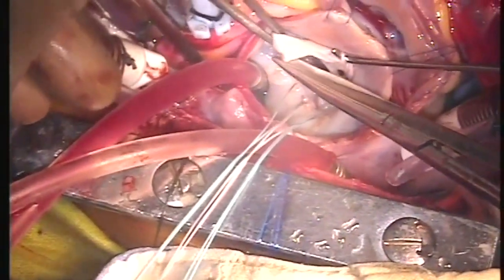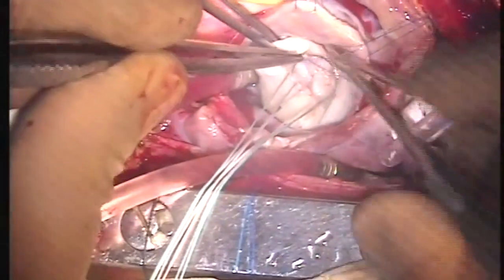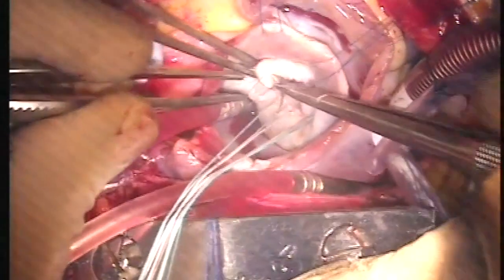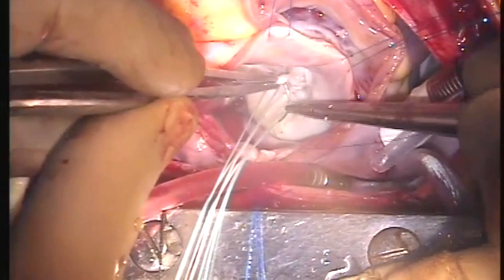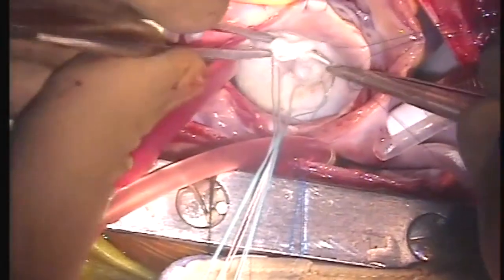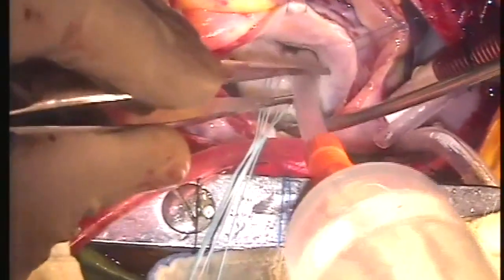Now the A2 segment is seen showing that the large segment at the center point there is a gap where there are no primary chordae. So one primary chordae was cut and sutured more medially so that we can have a primary chordae at least 4 to 5 millimeter distance, and this is a secondary chordae of A2 which is transposed to the A2 primary segment, so that there is a sufficient chordae at each segment.